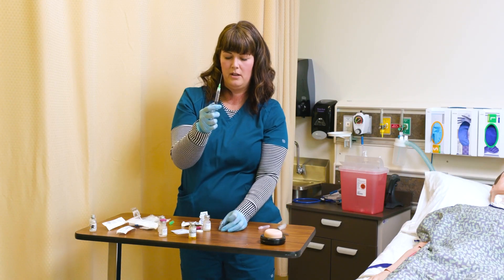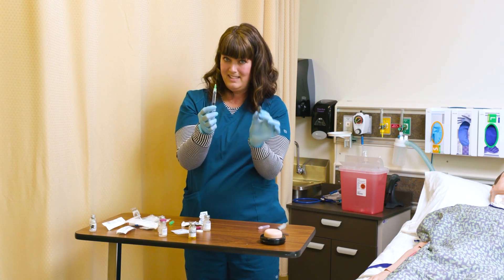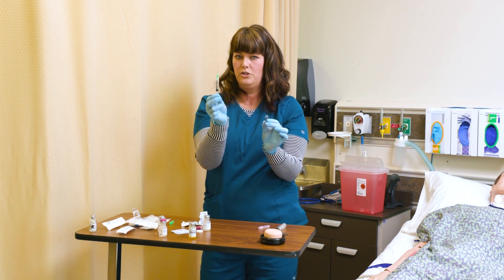I've drawn up all of that. Sometimes I may need the ampoule to scan it. If I don't, it's considered a sharps. I have two mils of fluid.